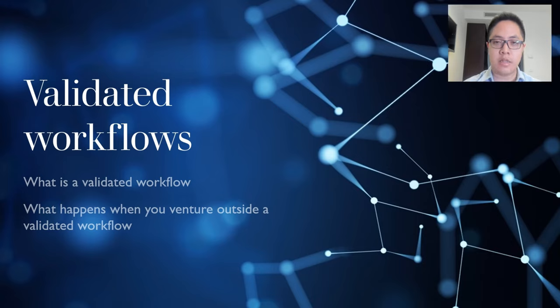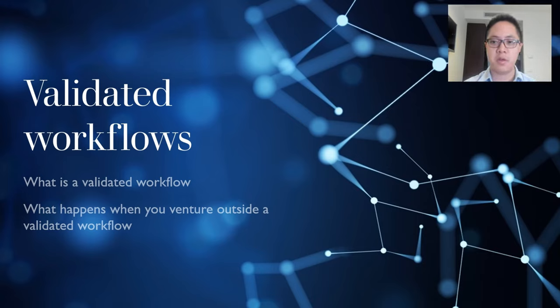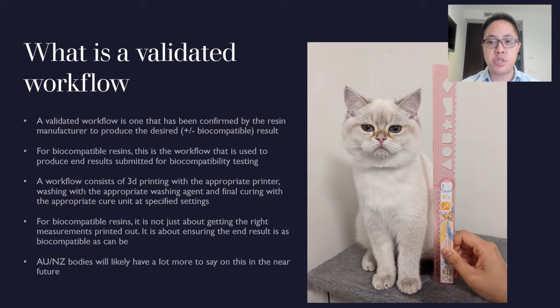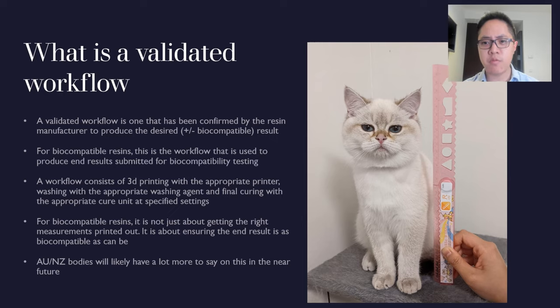This leads to validated workflows. A validated workflow is one that has been confirmed by the resin manufacturer to produce a desired result. If you follow a validated workflow and repeat the process of printing, washing, and curing to the letter, theoretically you should get the same result every time. For biocompatible resins, this is the workflow used to produce samples for ISO testing.